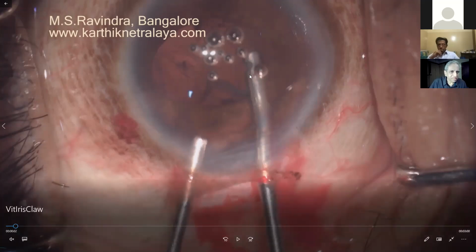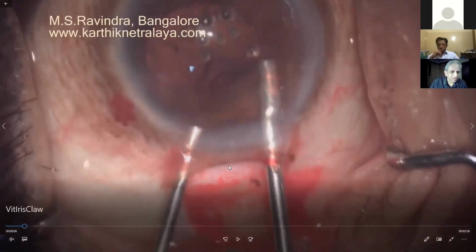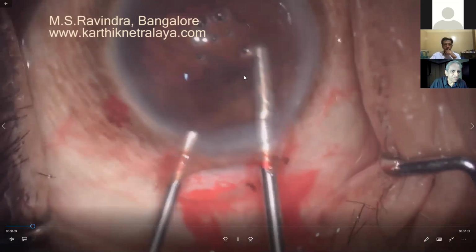So I've taken a 23 gauge port and that starts doing vitrectomy. I will not start doing vitrectomy here. If there is vitreous in the tunnel already, I'll clear the vitreous that has come out here. Obviously, the vitreous is limited to the pupillary space here, pupillary plane. And I just go there and just in the plane of pupil, I'm doing the vitrectomy.